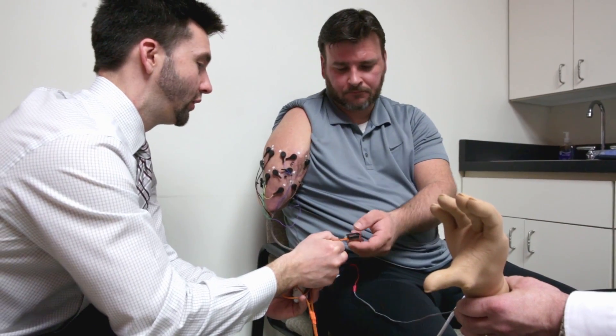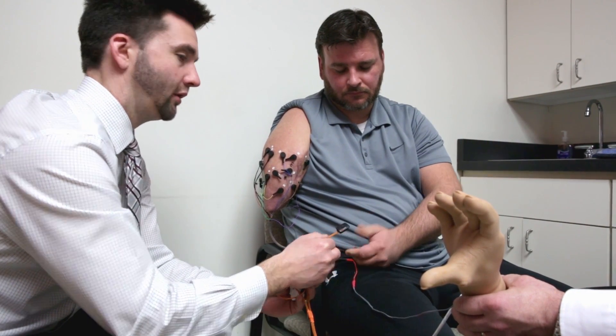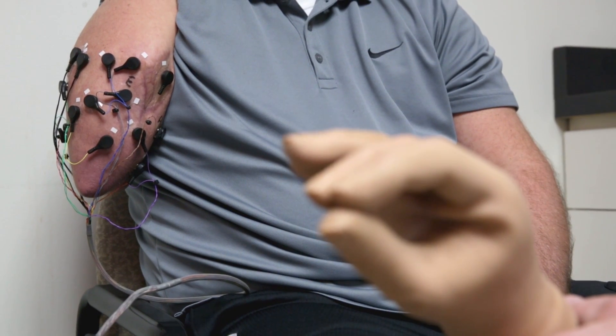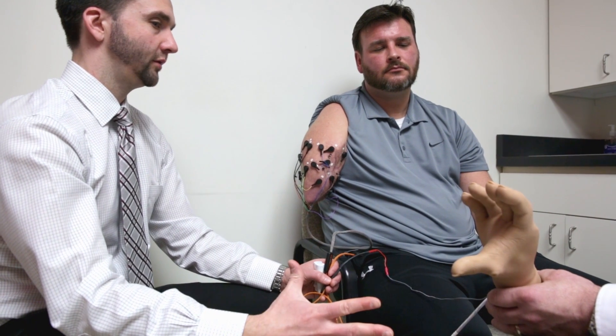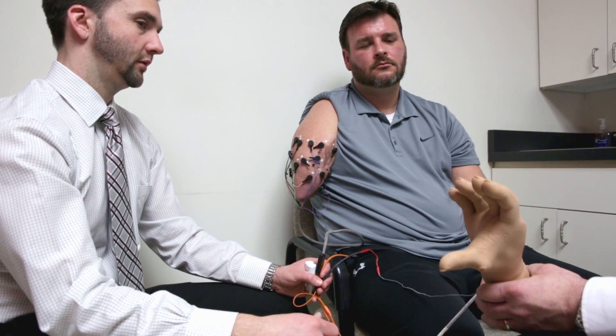You ready? Hold that until you hear the beat and let go. Great, you let go. So now you follow along: Close. Relax. Open. Relax. Close.